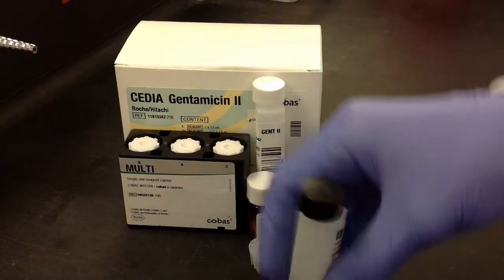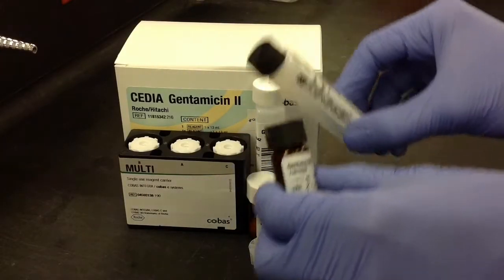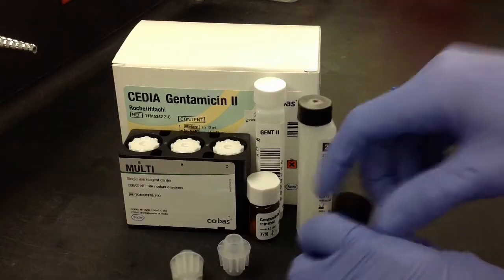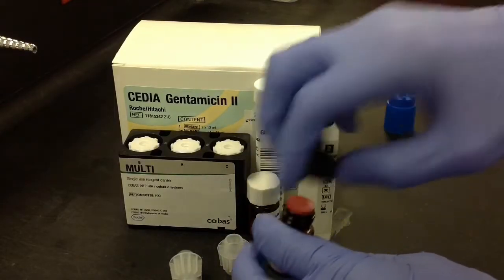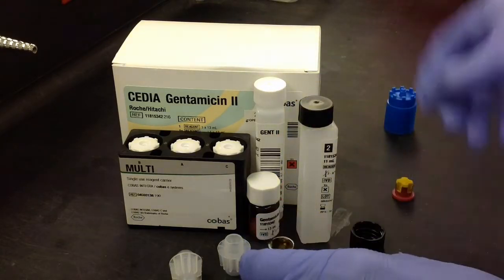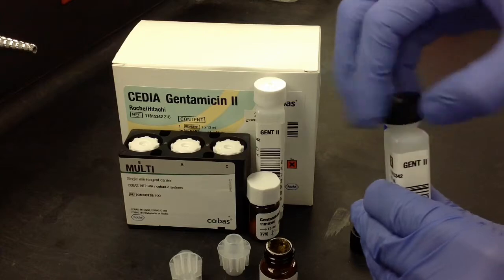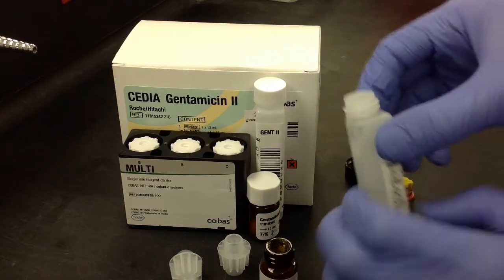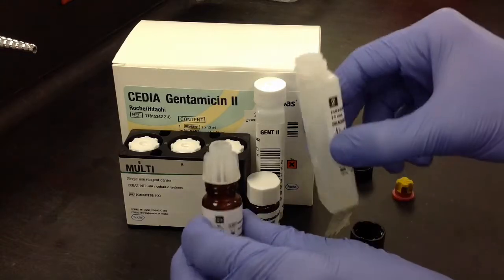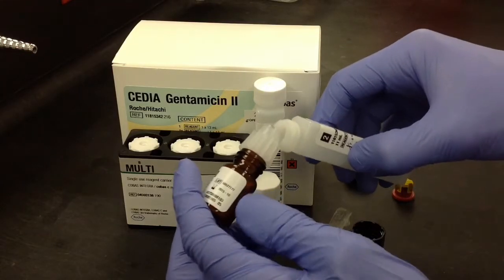The first thing you have to do is take the gentamicin, the corresponding cap colors. You're going to go ahead and mix these two reagents. One is lyophilized and one is a liquid reagent. Roche, in the instructions, recommends that after you mix these, you just separate it back into the number two bottle where the liquid originally came from.